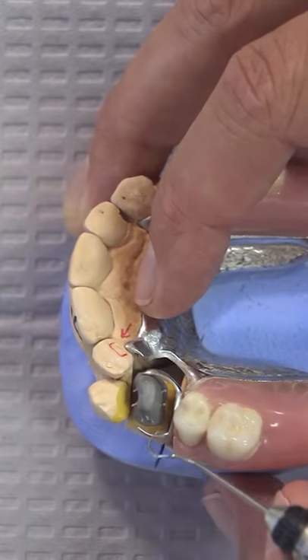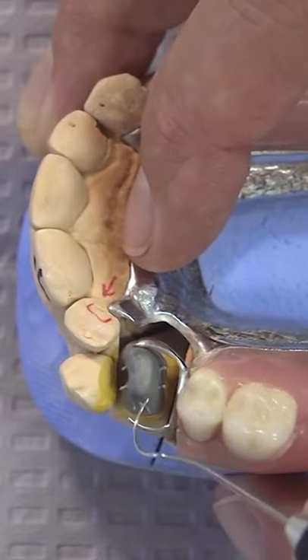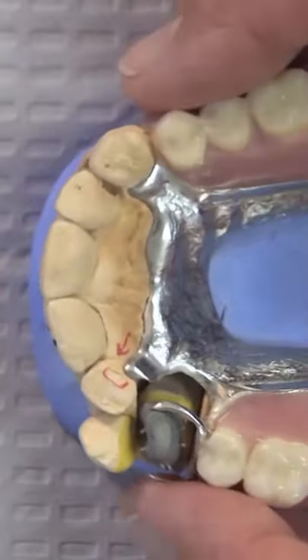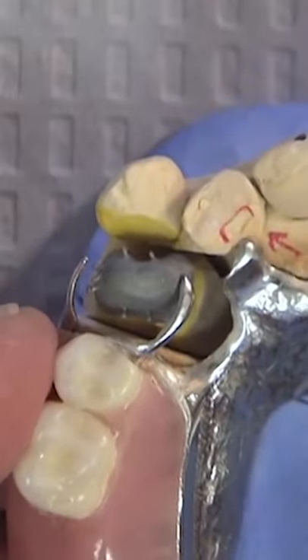So really all we're trying to do is take some acrylic and hook this clasp to this coping that's in place. Let it hook onto those arms so that it stays in there when we take the impression. Then we're going to take a full arch pickup impression over this, and the partial will come out with the coping locked into place. He'll send that back to the laboratory and now we will have a model that we can pour up.